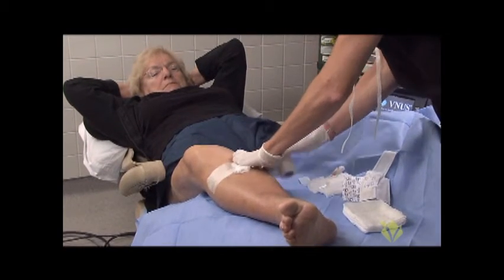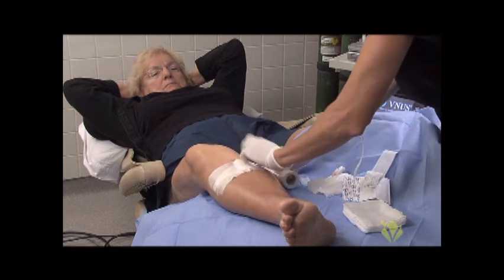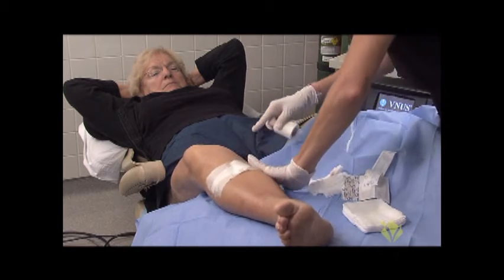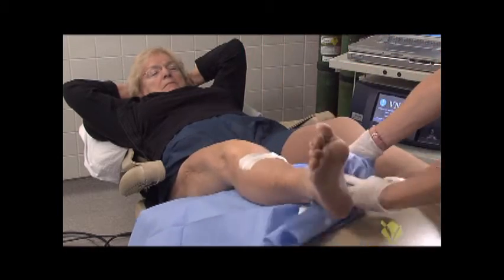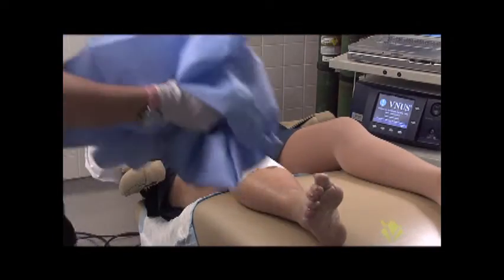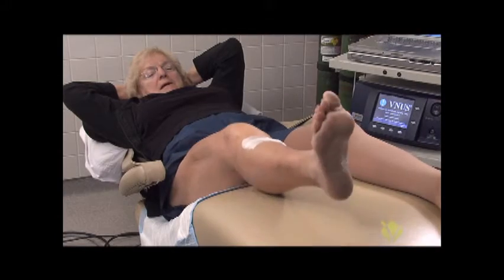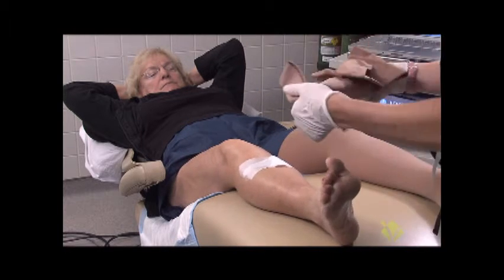This extra bit of compression helps when the patient stands up to prevent any bleeding. I like to make it as tight as I can. After that, we remove all of our trash, and the compression stocking goes on.